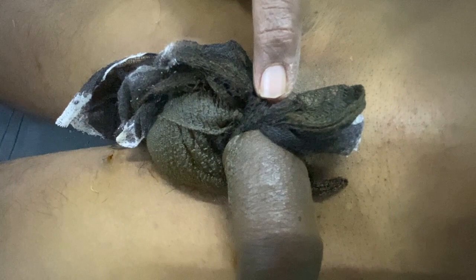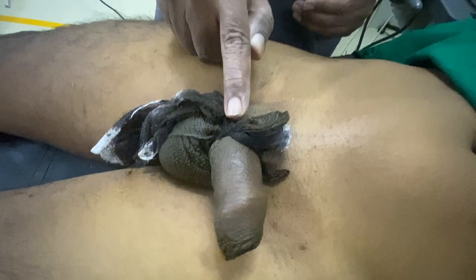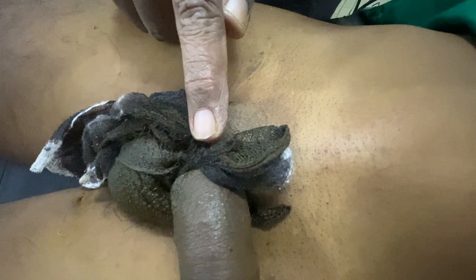This bandage is applied to avoid the bladder getting emptied by suprapubic pressure, because sometimes even a patient with a stricture can empty the bladder completely when it gets full, and then you are not able to do the procedure. One must remember to remove this bandage after the procedure.